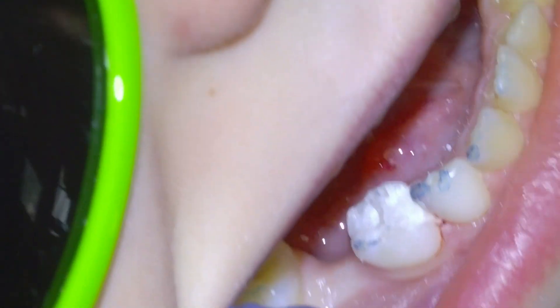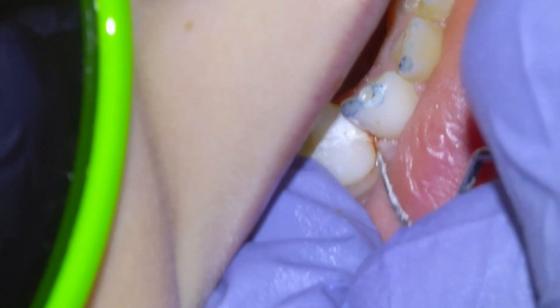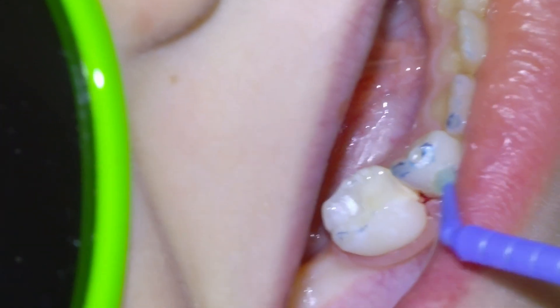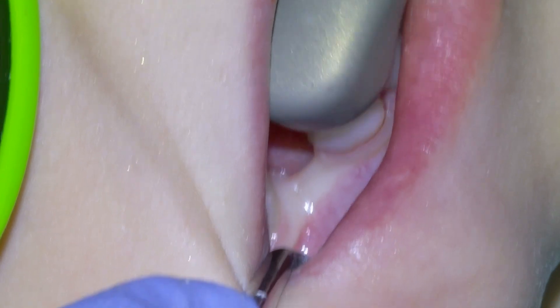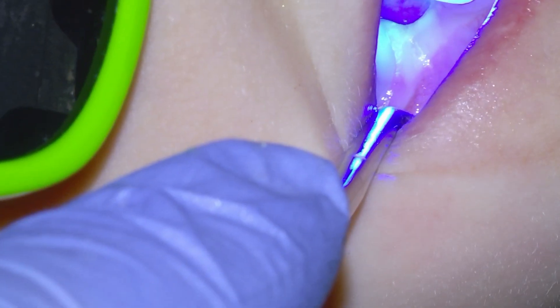Going to reduce the filling material until we're back on the natural margin, check the bite, remove some excess flash, and then apply our varnish material, Equia coat. The patient was referred to an orthodontist for space maintenance of the missing E. You can light cure our varnish material, and that's a wrap.